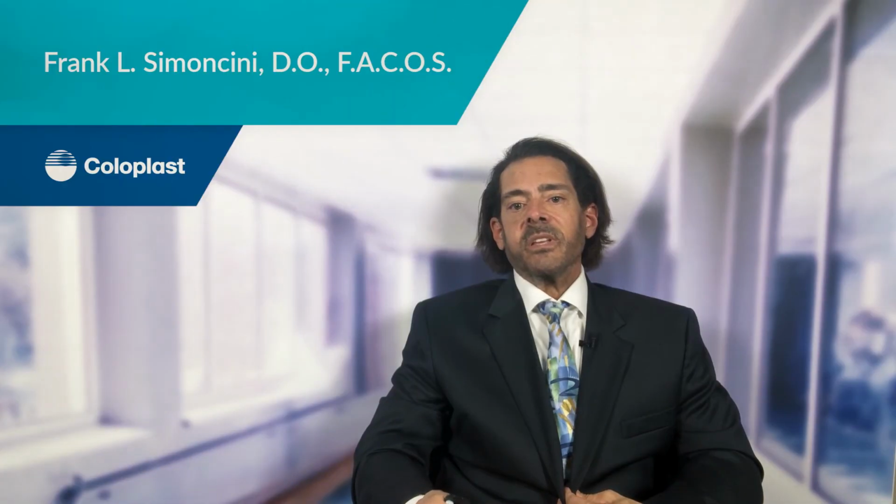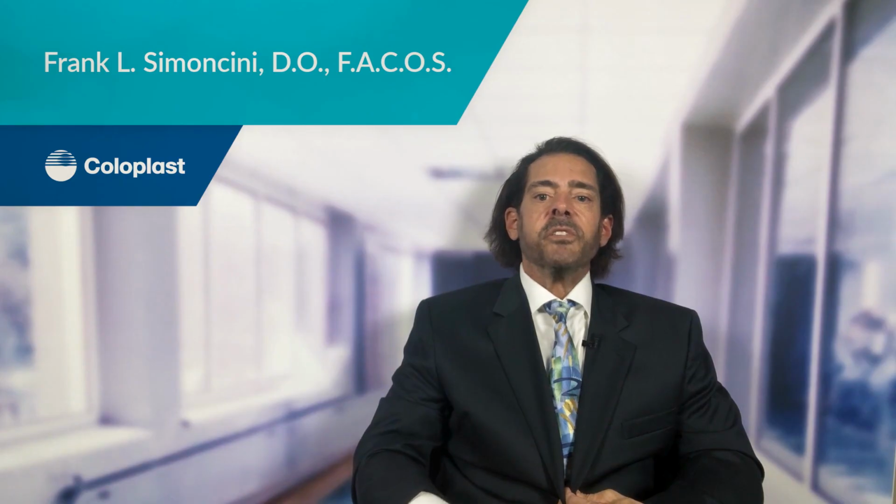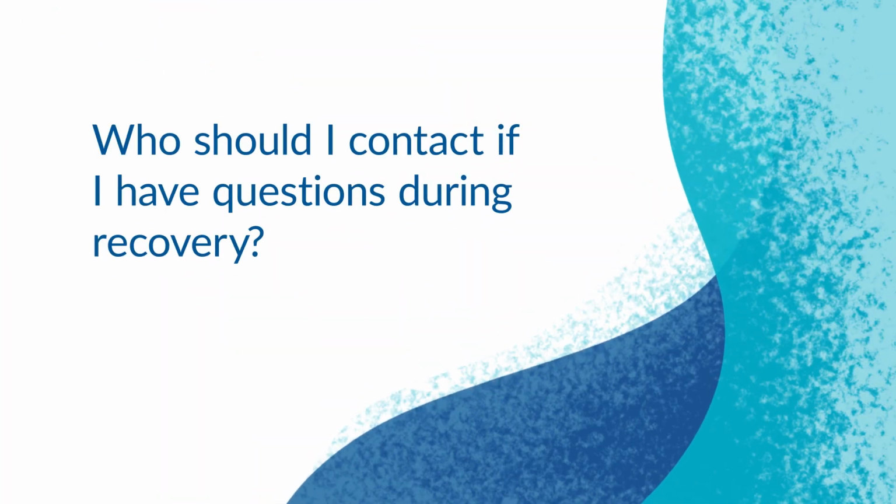Typically, you can use a penile implant within 3 to 4 weeks of the procedure. That being said, the incision has to be completely healed and you have to be comfortable pumping the implant up and down by yourself at that time.